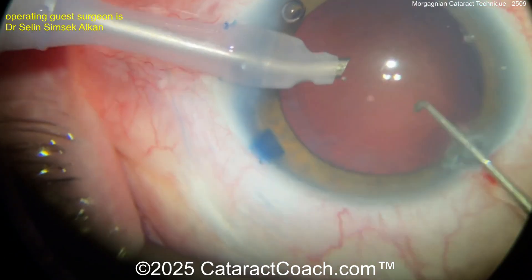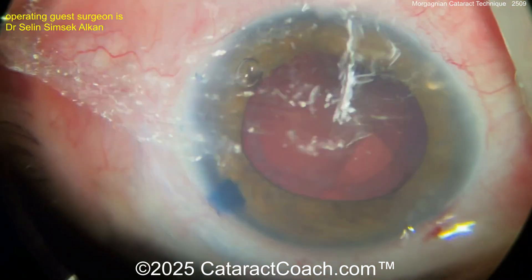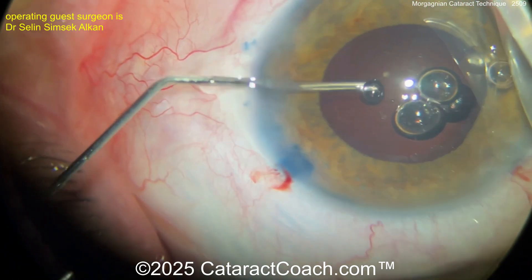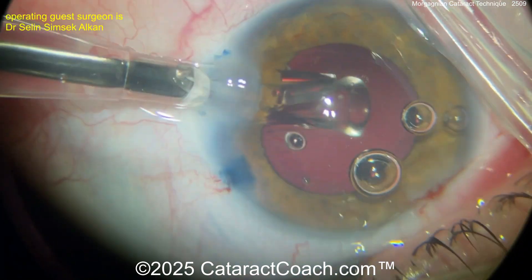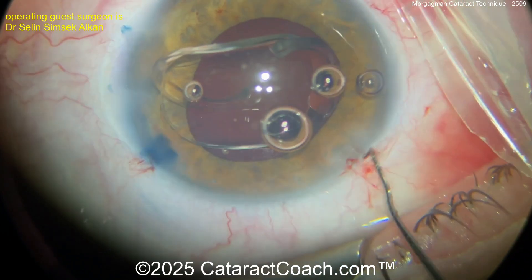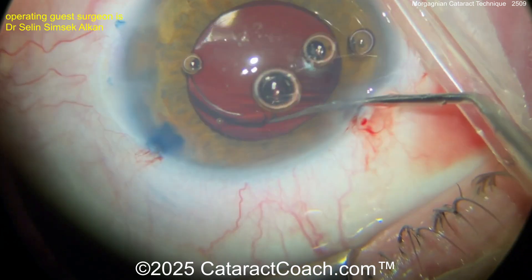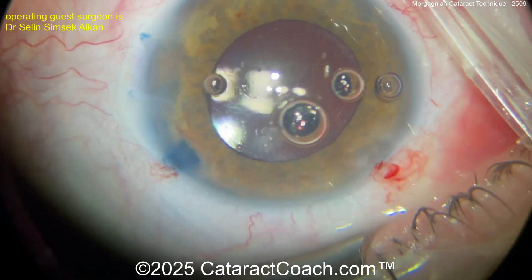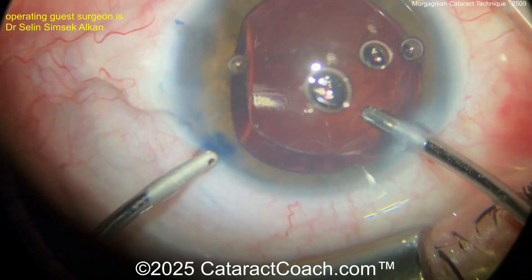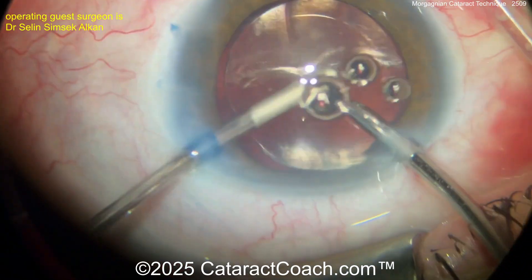Last few pieces coming out. Look at that clean bag — looking good. Very nicely done. So that is a Morgagnian cataract: so much of the lens cortex and even the epinucleus has liquefied, and you're left with a dense central endonucleus floating in that bag of liquefied material. Here's the monofocal lens going inside the eye — get that in the capsular bag, make sure it's all the way in the bag. Do not want this in the sulcus. Both haptics and the optic in the capsular bag completely. Now let's take out the remaining viscoelastic with bimanual IA. There's really not going to be much cortex to remove.